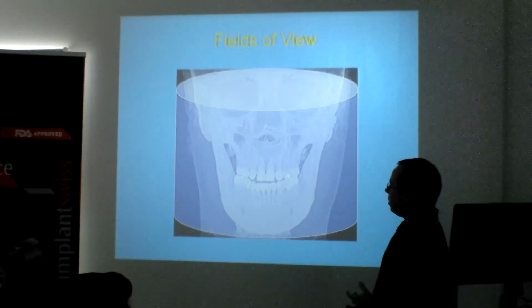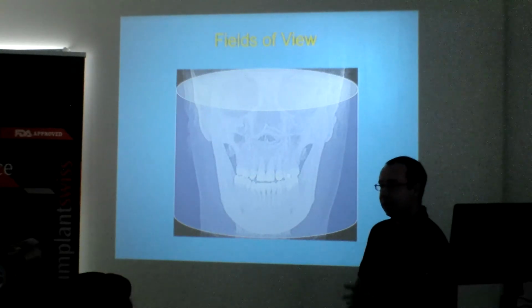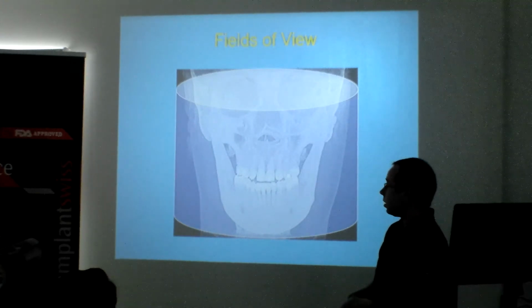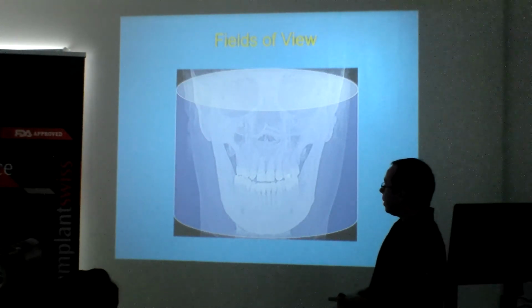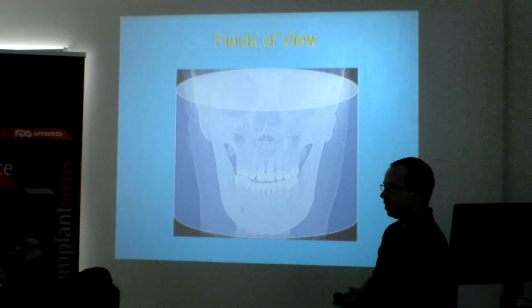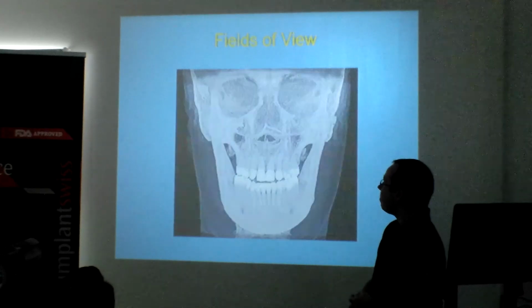So really for implantology, you'd be really looking at the small field, or in some cases the medium field, but you should never really be looking at a large field. And we do see this from practices where they send a scan to us to convert it into iCAD vision or to have a report done. And they're looking at placing an implant. You can see where the implant's going to go, but they've done a scan of the whole facial skeleton. And you think, why? There's no justification for it. You don't want to be seeing anatomy you don't want to be reporting on. There's no need for it, especially in today's age.